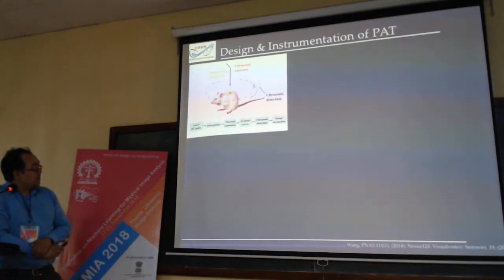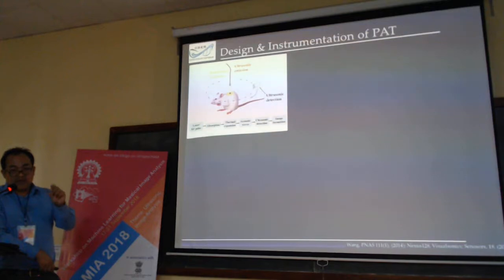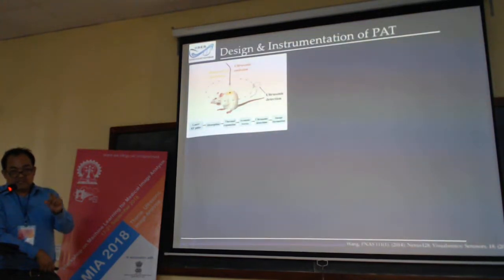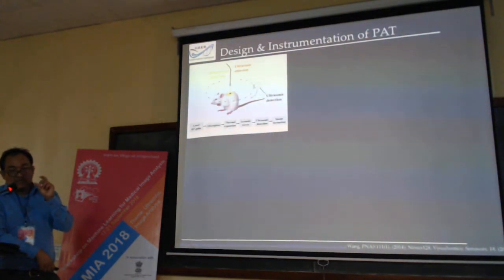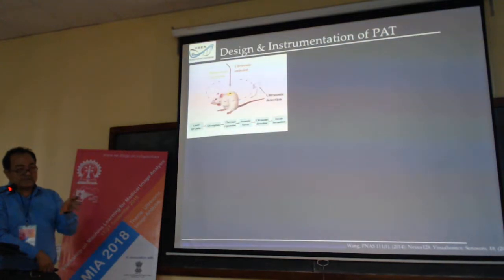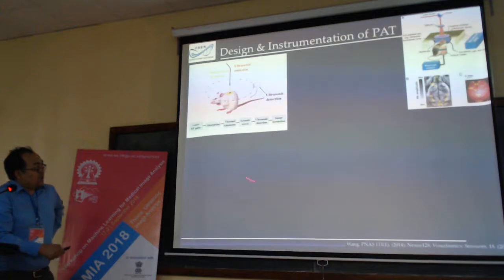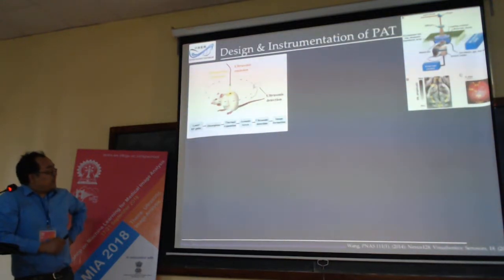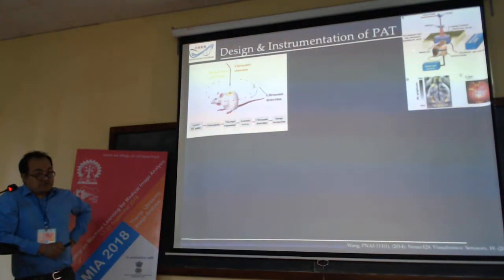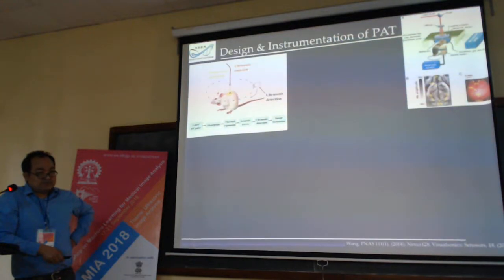So this kind of imaging system is limited to physical systems that are not time varying. Within that acquisition time, the system should not be changing with respect to time. That is the limitation. So after that, people used to do it with an array of detectors. Even in 3D, people did it and got results. However, still over here the resolution is very poor.